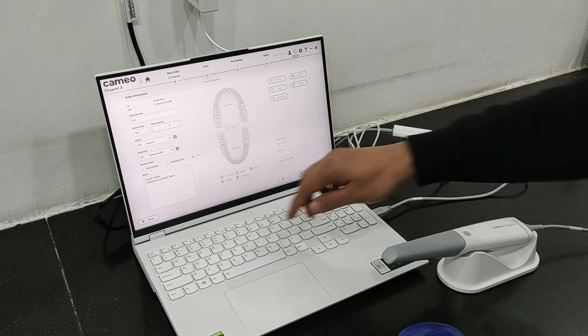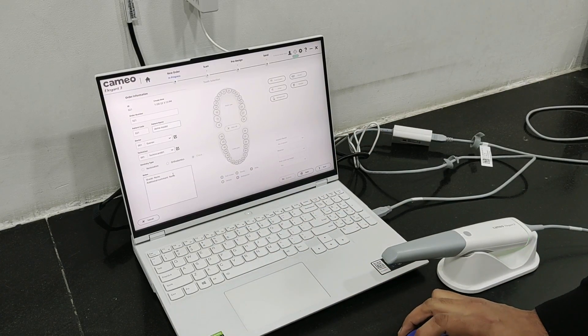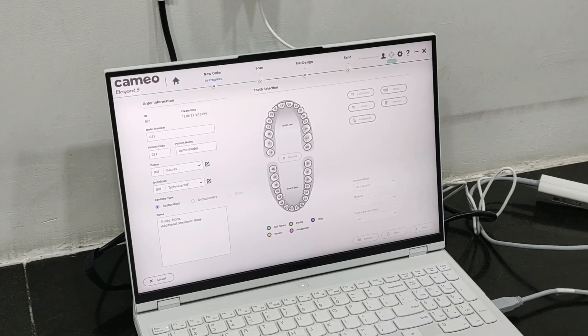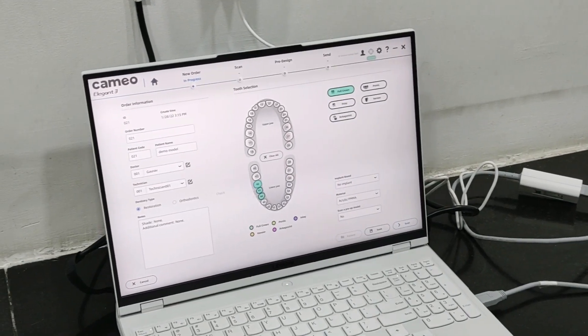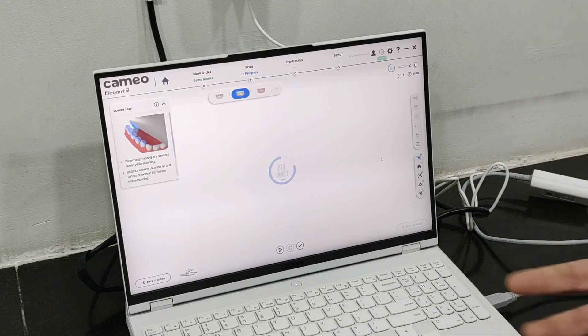Let's create a new order. For example, we have a demo model for restoration. As you can see, we have teeth 44, 45, and 46 which are prepared for a full crown. So we will mark them here — 44, 45, 46 for full crown and for zirconia. Let's go to scan. Now scanning is ready. It is heating up; once the tip heats, then we can use it. Heating is there to prevent fogging of the mirror, otherwise you will not get a clear scan.